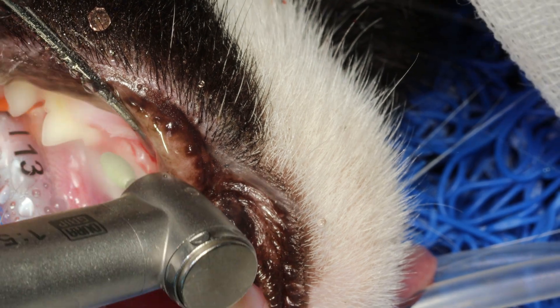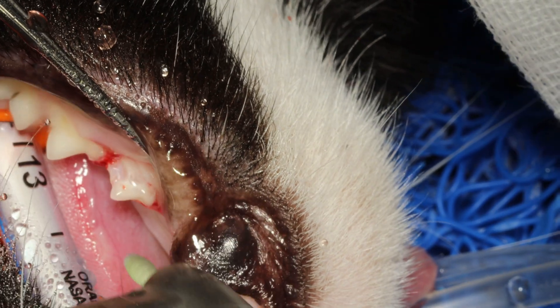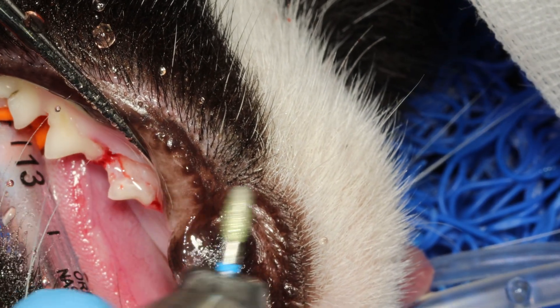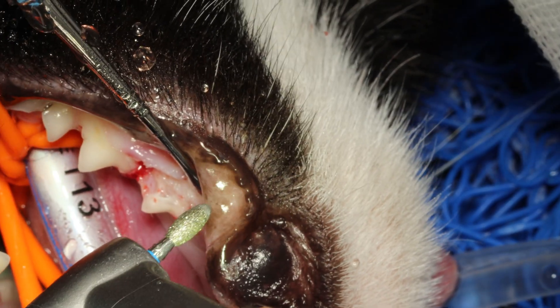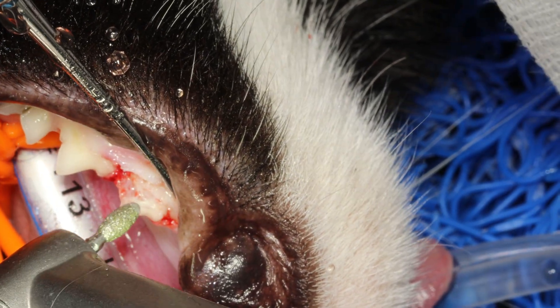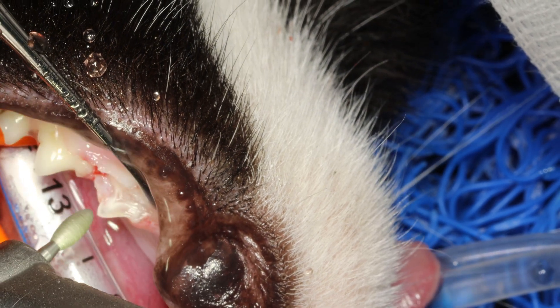I am using a diamond football burr. You can use any type of diamond burr. Don't use a round burr — not a carbide round burr — because you will damage the soft tissues. You can use a medium grit like here or a coarse grit.